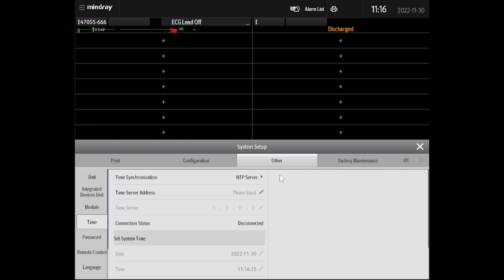This is because your time is being served from either an eGateway or NTP server on the network, and you'll need further assistance for synchronization. Once set to manual with the proper date and time, exit out, and your task is now complete.